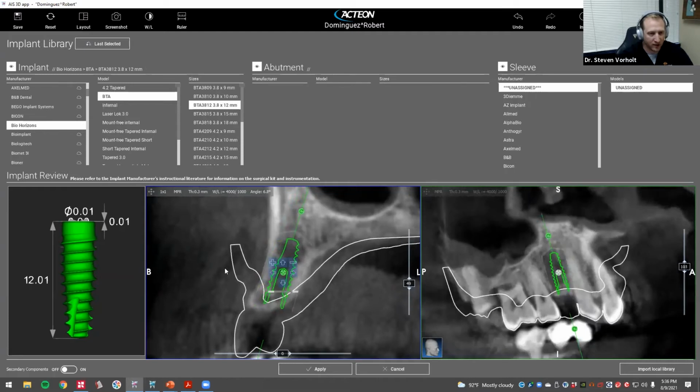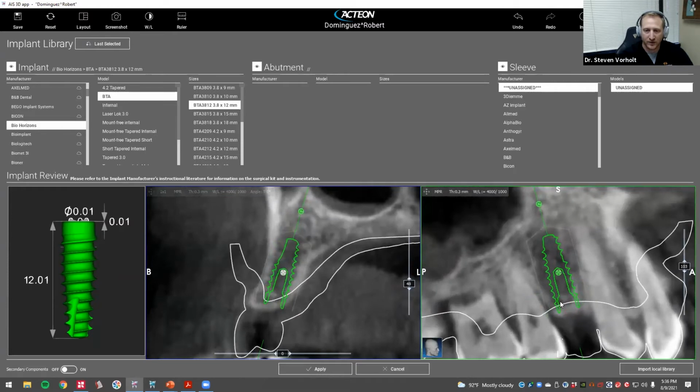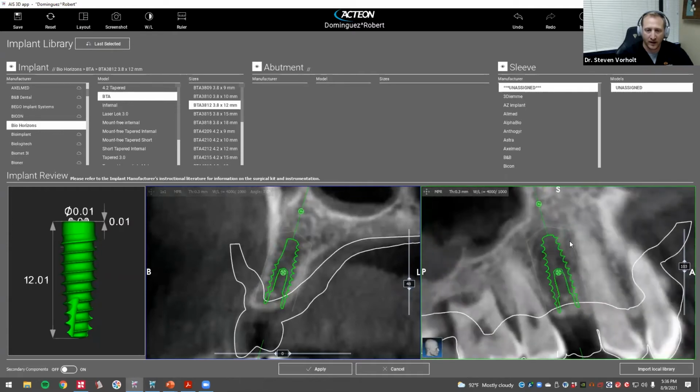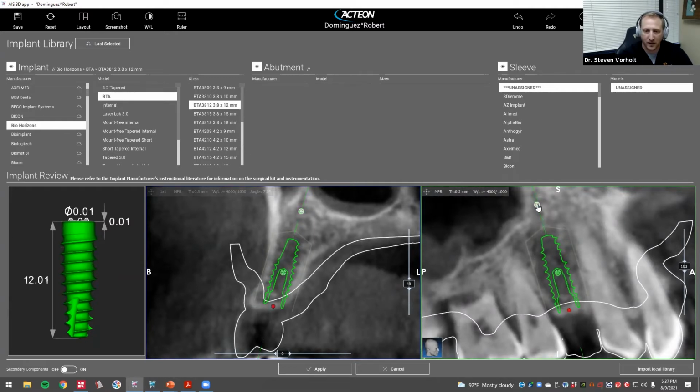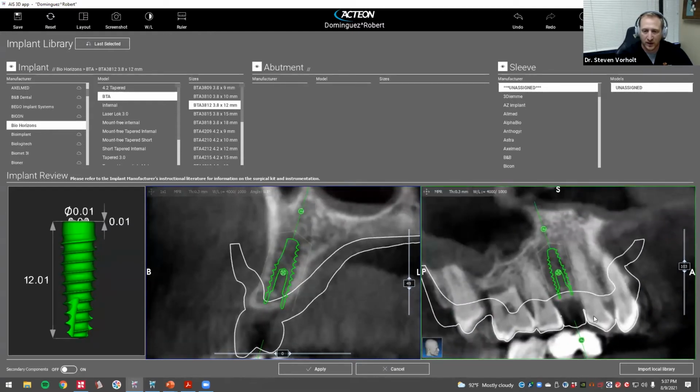We're doing a guided case. We have a cone beam. We're going to place this a little bit more palatal. We're going to then take a look from the side and make sure that we're not anywhere near those roots. And we know that number 6 does have that distal turn, so we're staying well away from that. Acteon has this nice little outline here that's 1.5 millimeters, like a little safety zone outline. So if that does not impinge on any PDLs or teeth, then I know I'm in good shape. So I'm just going to get that to be the perfect angle right between the contacts. I'm trying to parallel the contact point here.